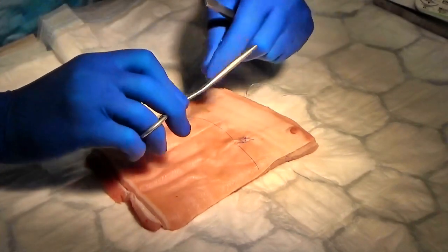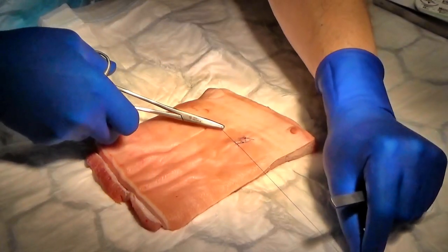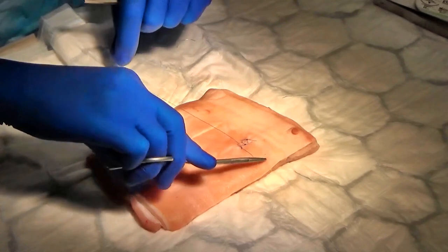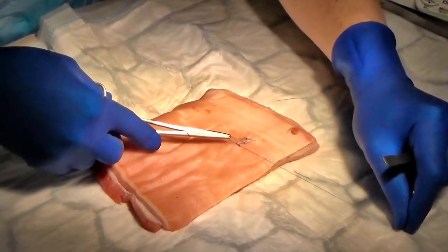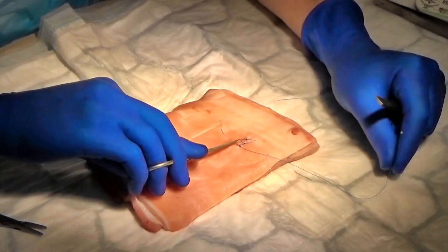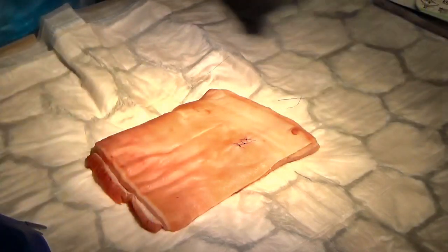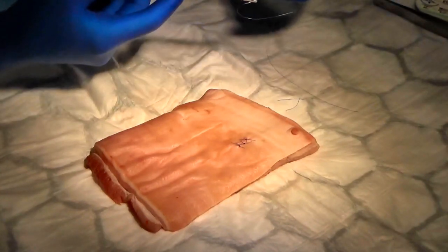So it's once, twice, grab, once the other way, pull your knot over to the side, and a third one to lock it. Cut your sutures about 6-7 millimeters in length, basically so that somebody can grab hold of them and take them out easily later on.